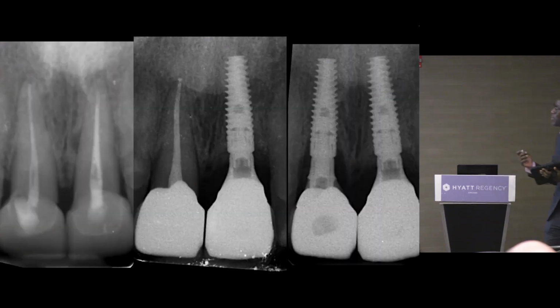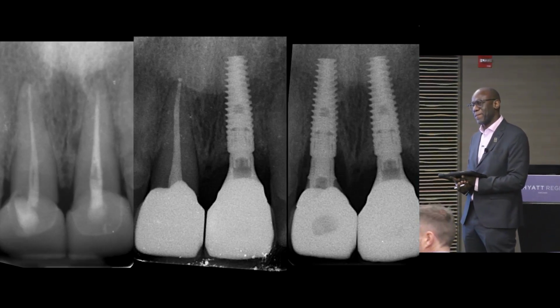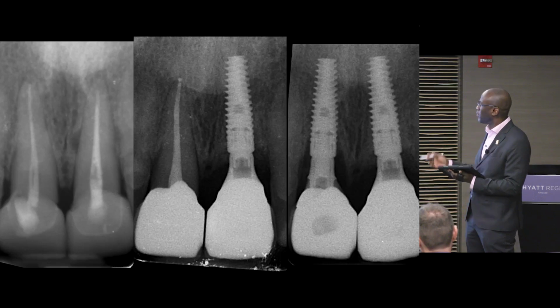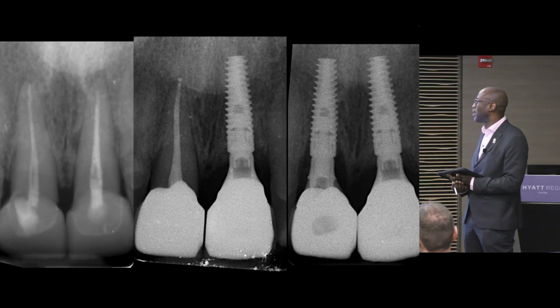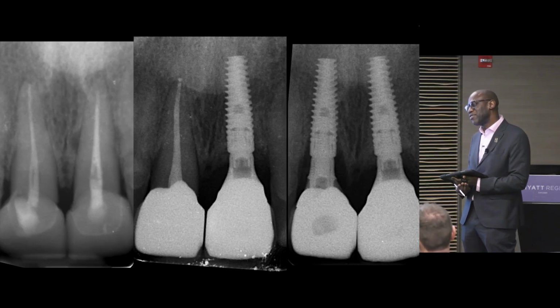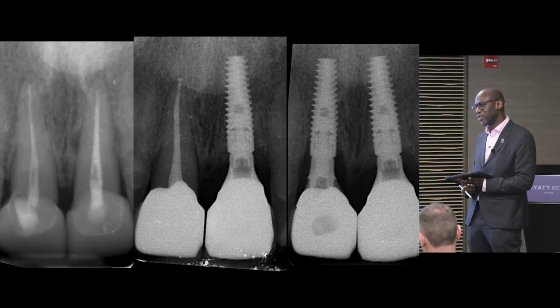And again, when we have a look here, yes, please do. Have you noticed the papilla height, the loss difference between old and... Between, in this case or in general? In general, but this case as an example. In some cases you do lose a little bit, mainly the distal papilla on central incisors. With a different height of the tie base, I can't really answer that because I would need to see many cases over a period of time to give you a definitive answer.